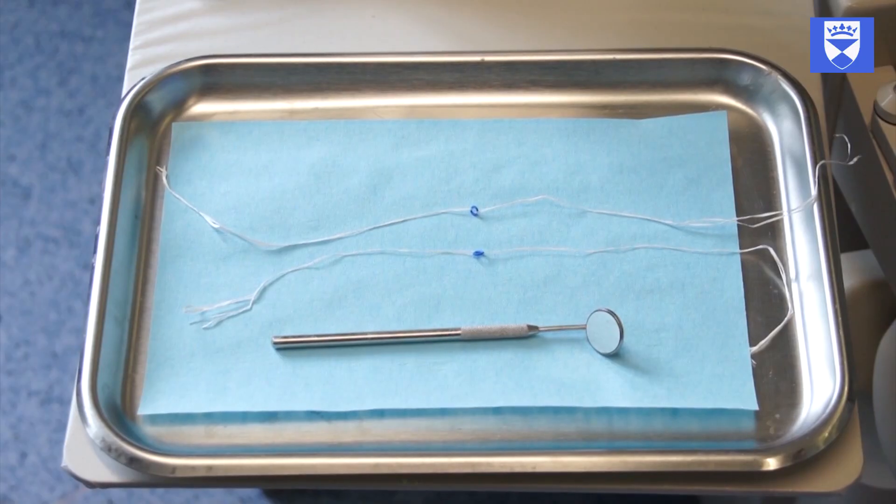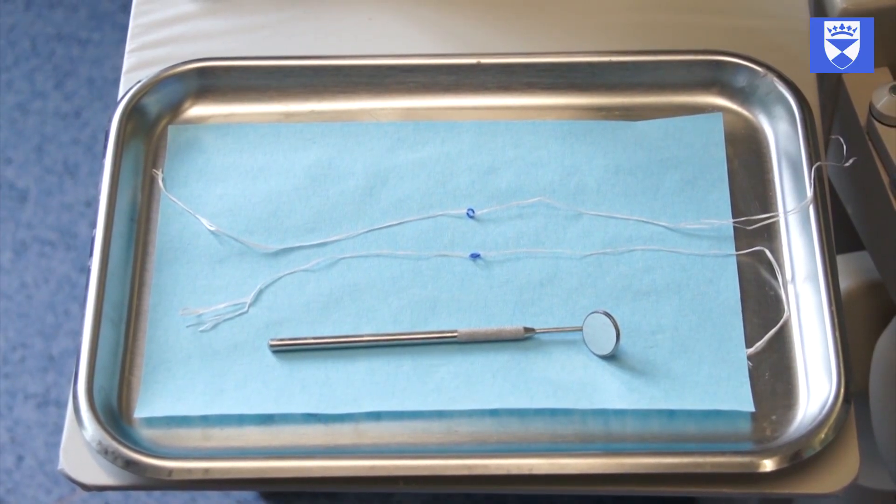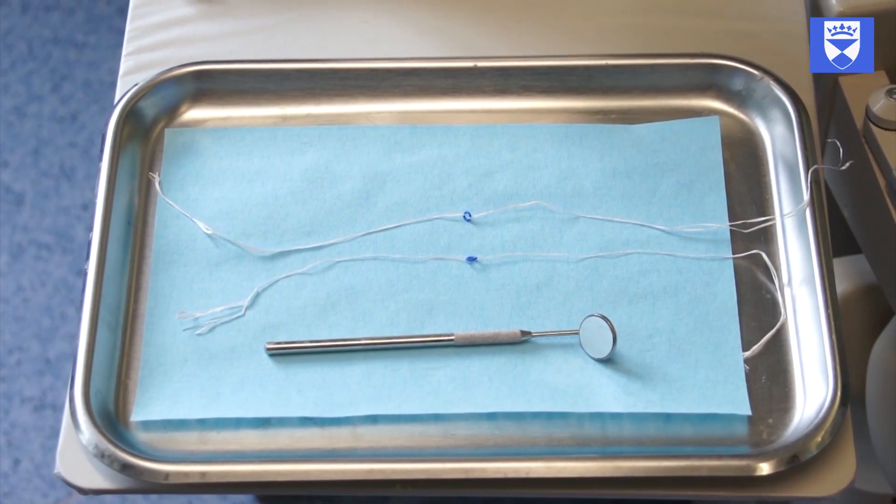This video demonstrates a predictable and reliable method of placing an orthodontic separator. This is particularly useful when undertaking the Hall technique, which will be covered in a separate video.